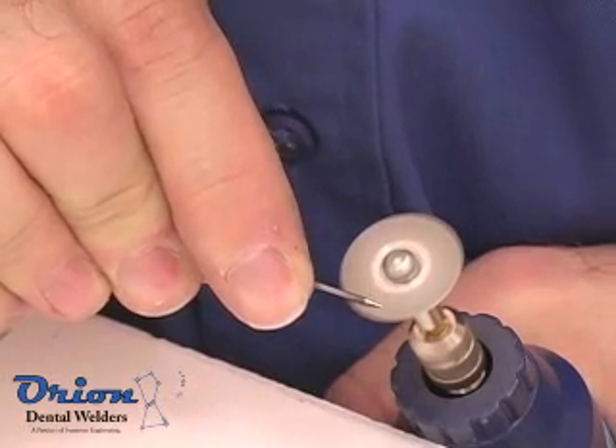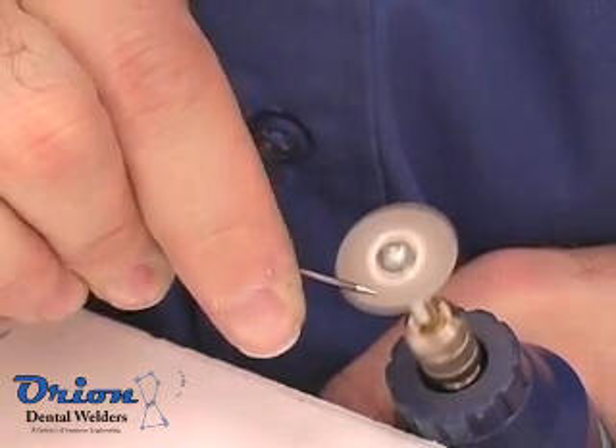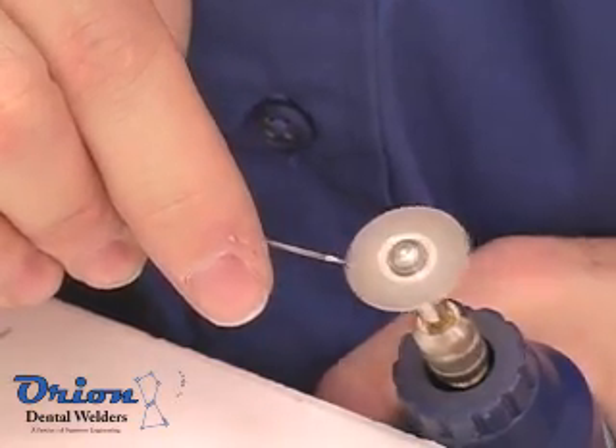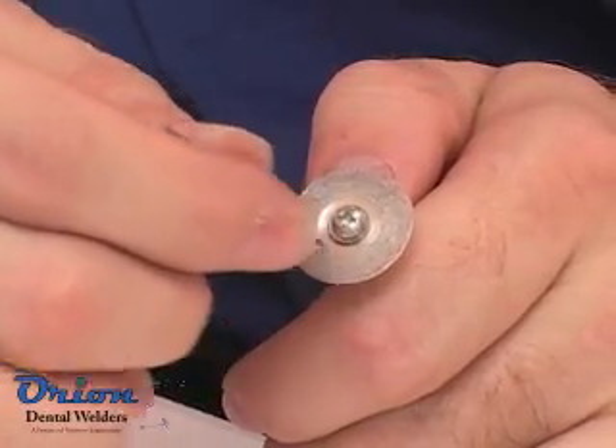Always use a diamond wheel to sharpen the welding electrode. Grind the electrode down the length of the body to produce parallel lines and not rings. Make a very small flat at the end of the electrode to increase arc stability.